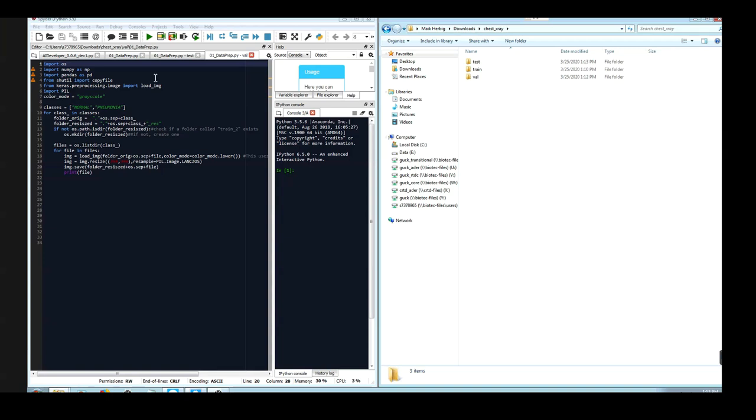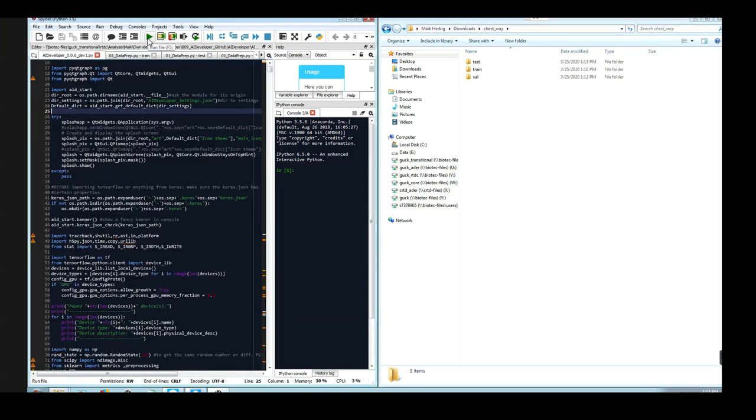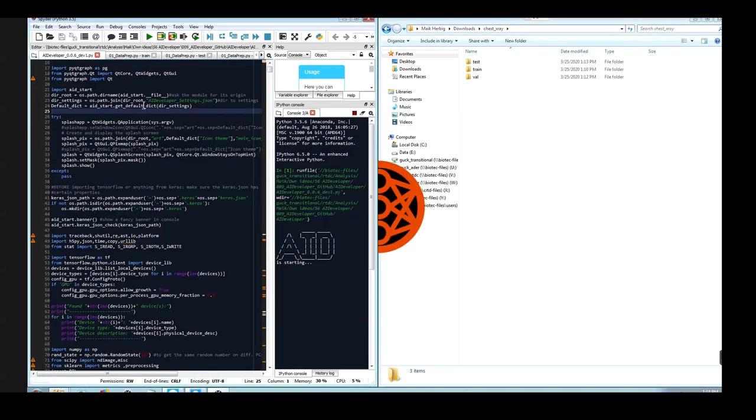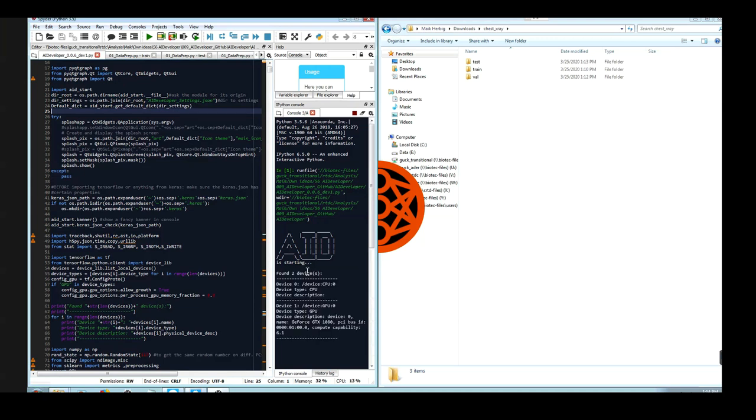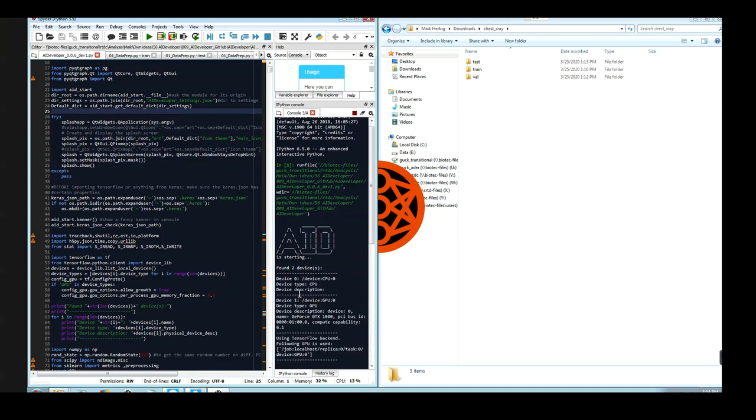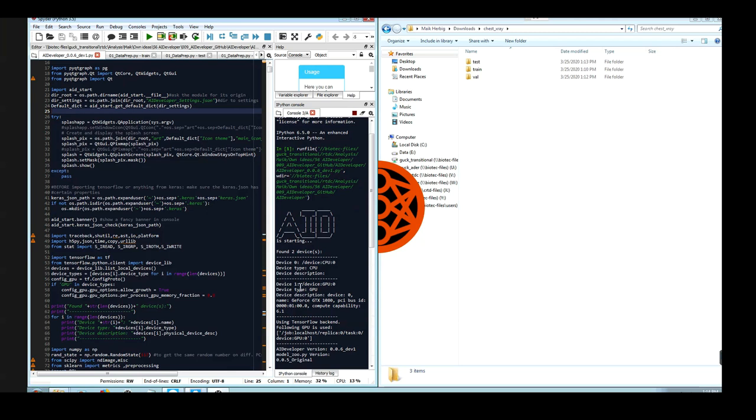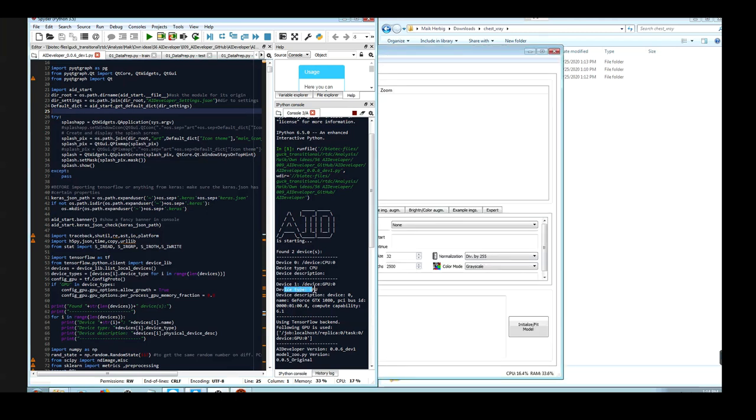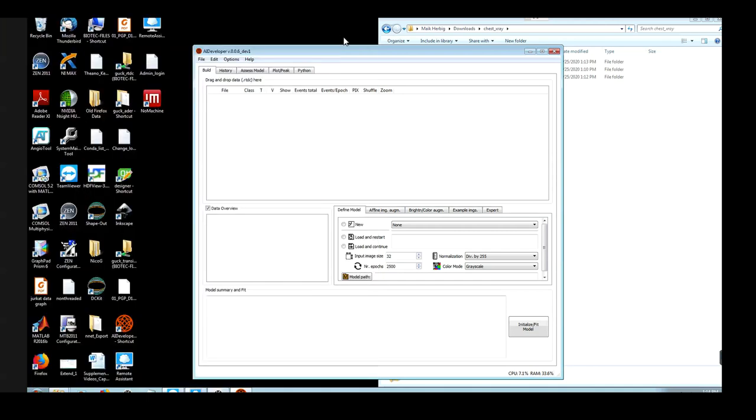So we can now start AI developer. As I said, I will run AI developer from script, which allows me to use my graphics card. So when you start AI developer, you will see that the device type now is GPU, and here is written the GPU it is accessing.